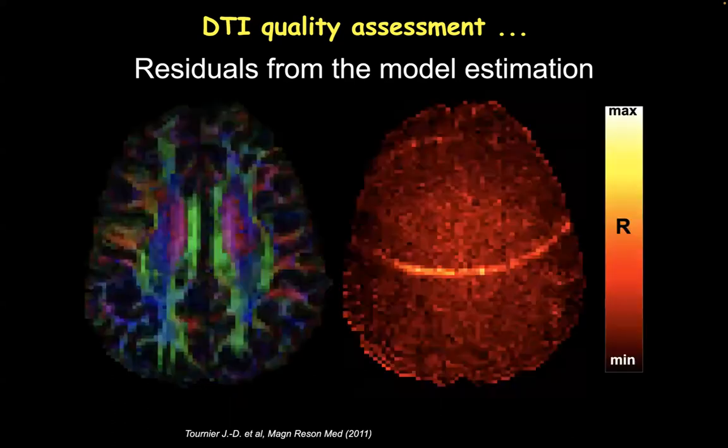But if suddenly, like, I wouldn't have seen this ring on the FA. It's very hard to pick up. But there's actually an image artifact, a ringing artifact from image folding inside the image, and you can see this big ring. Will this affect my analysis? Are these tracks important? You need to think about whether you remove this subject or keep it, but this is a big artifact that may be polluting your radial and axial diffusivities.